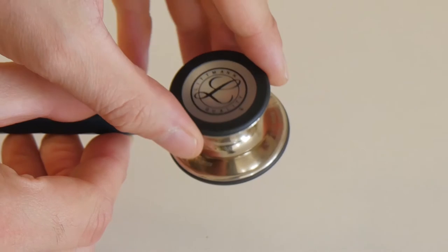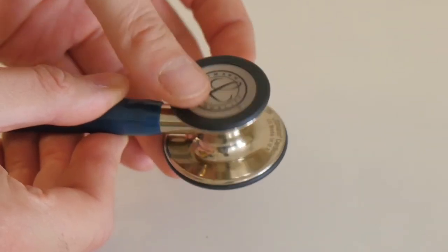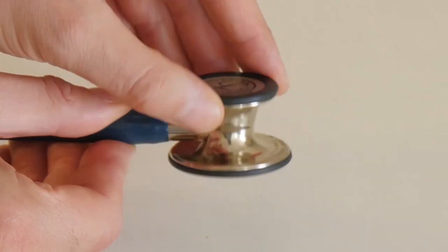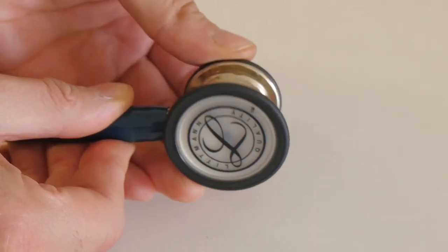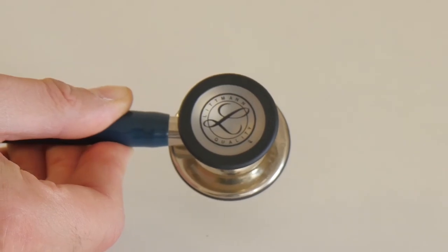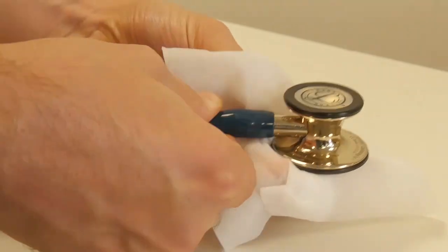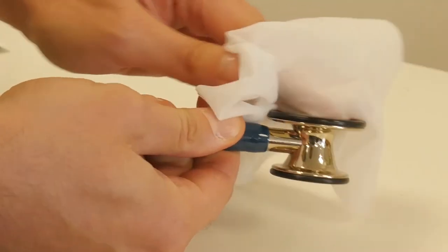The 3M Littmann stethoscope is a great option for students learning how to use a stethoscope. Simply adjust the pressure applied to the chest piece — high pressure for high frequency sounds, low pressure for low frequency sounds. 3M recommends cleaning Littmann stethoscopes with a 70% isopropyl alcohol solution or wipe.